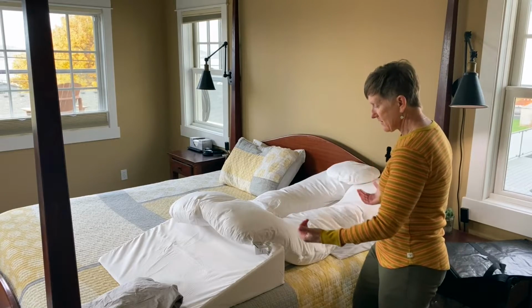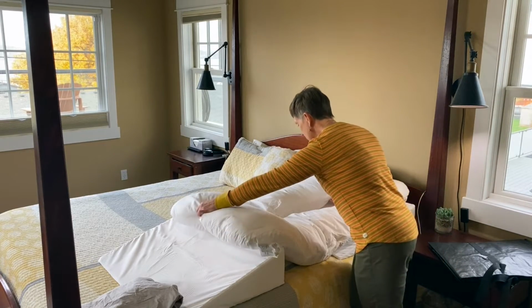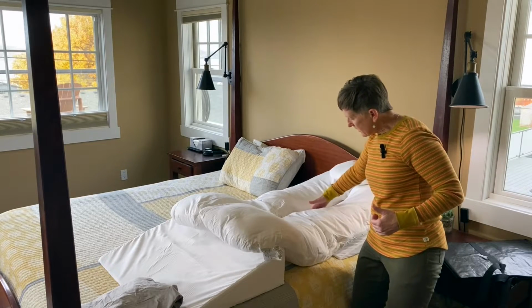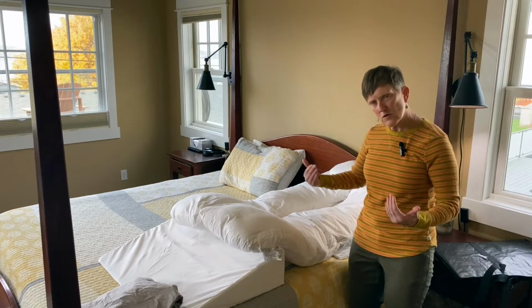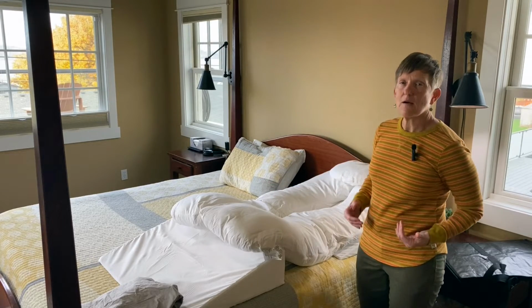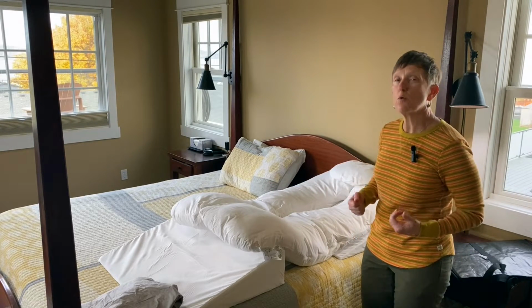I like to have the setup close to the edge of the bed. I think it's easier to get into. There's a little cutout right here, and that's where your spine is supposed to sit. But our body is going to be right on top of the pillows so that we're just supported by that pillow system.